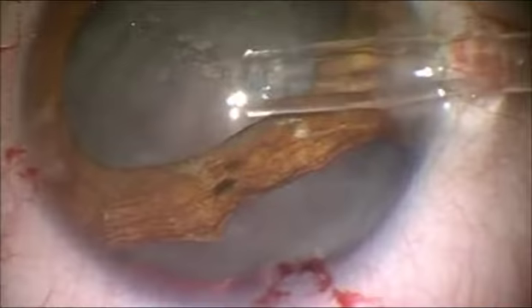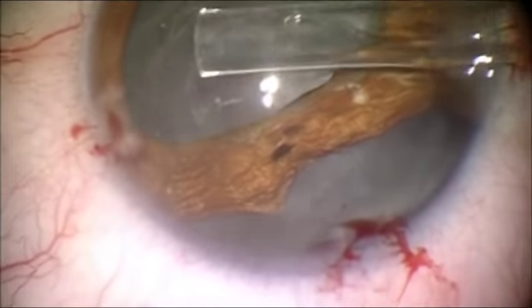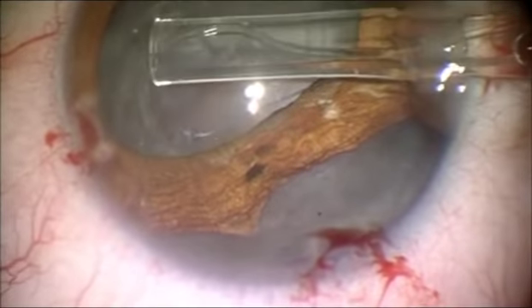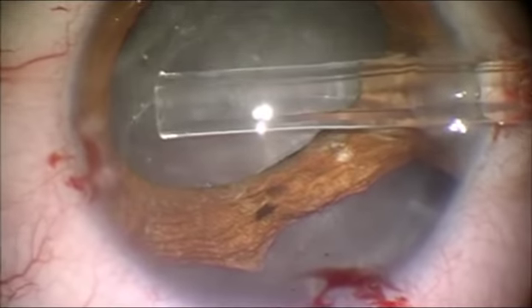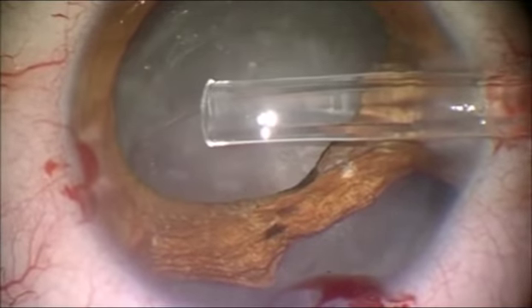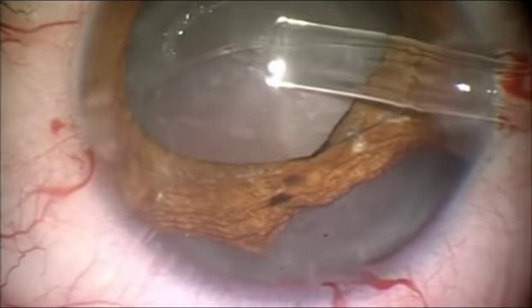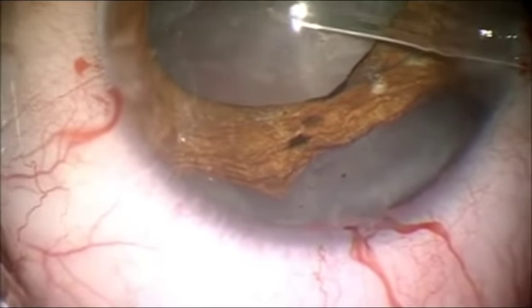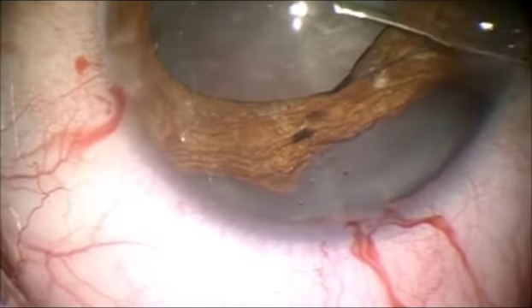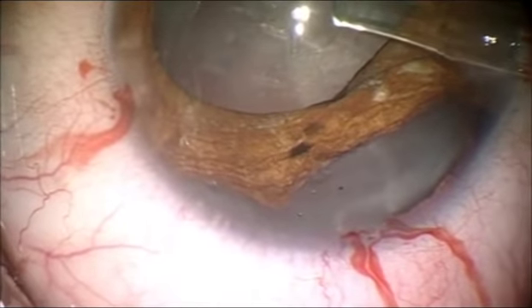And while injecting the CTR at the beginning of the procedure, we can actually see how it goes through the transparent injector tube. And actually, you can also see the fixation element of the device sliding along the equator of the capsular bag, which is visible now because of the iris defect.